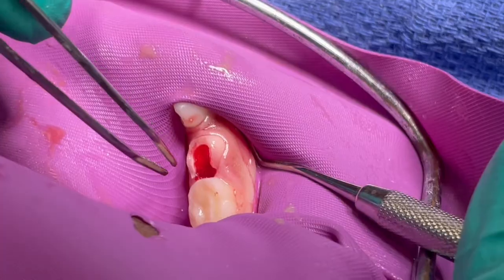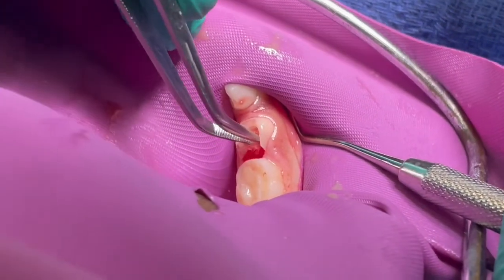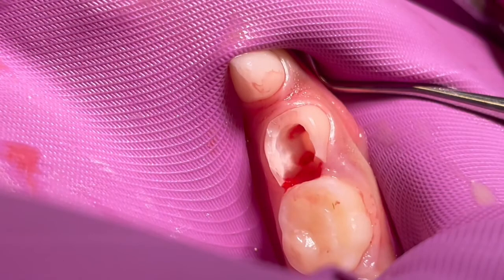After completing my crowns on A and B, I remove my packed cotton pellets — and this is what we want to see. Looking at the mesial and distal areas of the pulp chamber, you can see good hemostasis; there's not excessive bleeding. If I still see substantial bleeding after removing pellets, I would inspect the chamber for tissue tags or significant pulp tissue remaining in the canals, and also ensure I'm not getting accessory gingival bleeding from a deep carious lesion. If it's still bleeding significantly, we need to think about whether this tooth needs a pulpectomy or extraction.